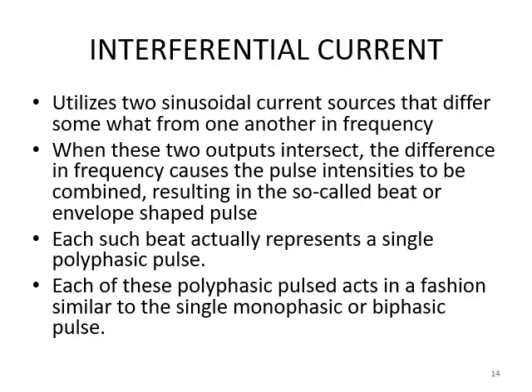Next type of stimulation is interferential current, and here there is an actual interference between two medium frequency currents. This system utilizes two sinusoidal current forms, and these currents differ in their output, so that both the waves are slightly different in frequency, so that they do not match their peaks and troughs at the same time throughout the series.